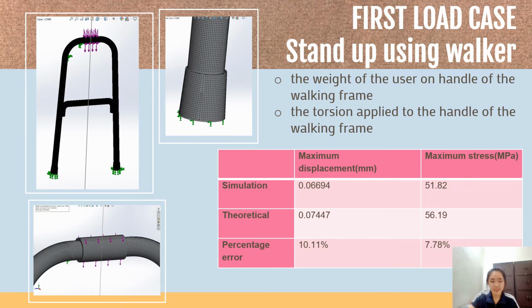Mesh convergence study is done for this load case. The maximum displacement and the stress are simulated from the analysis. The table shows the value for simulation and theoretical. The percentage error for the simulation and theory is calculated to be 10.11% for displacement and 7.70% for stress. From the calculation for percentage error, it is acceptable as the percentage error is around 10%.